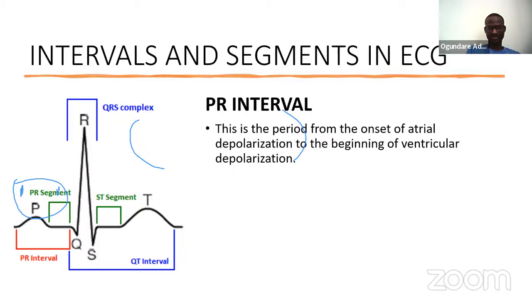So, to be more formal, it's the period from the onset of atrial depolarization, which is the P wave, to the beginning of ventricular depolarization.